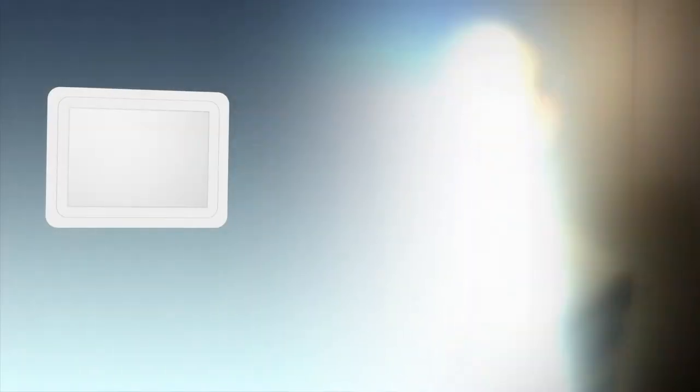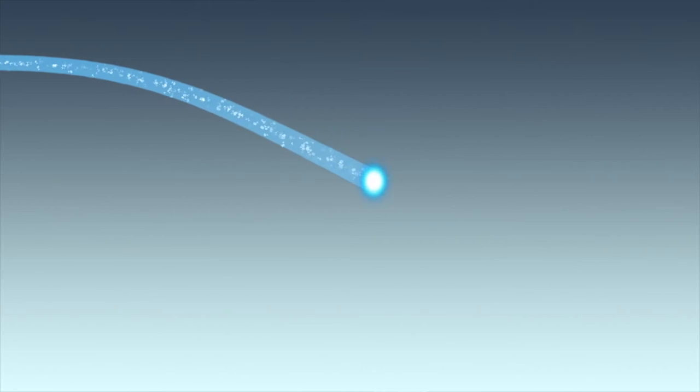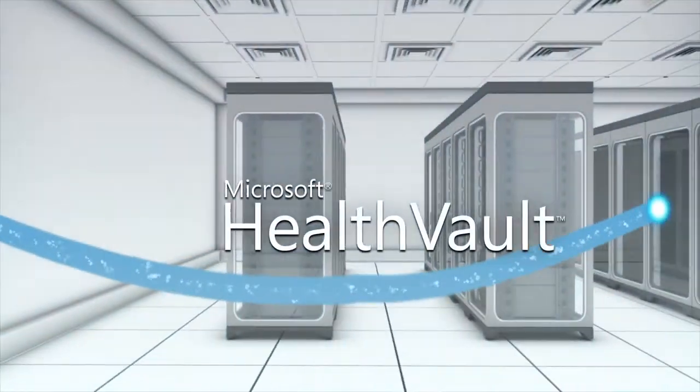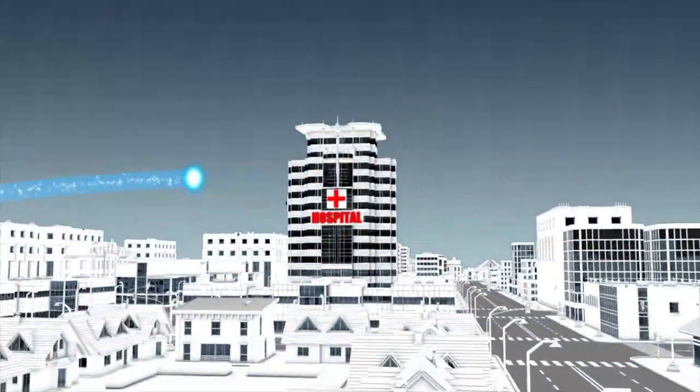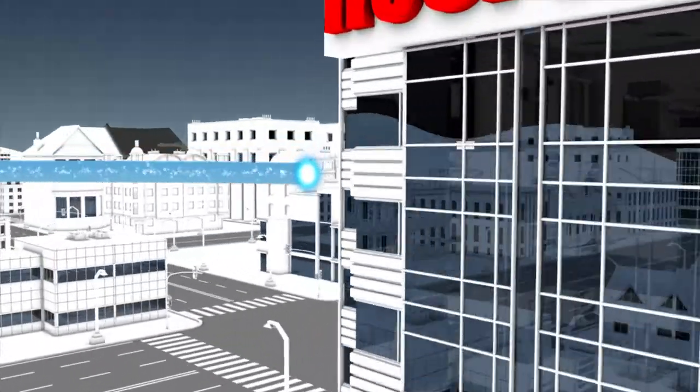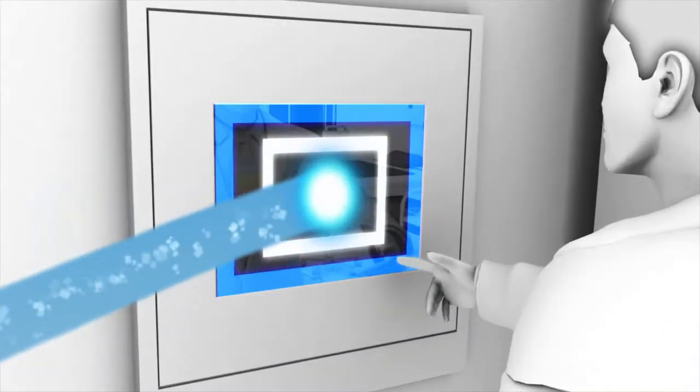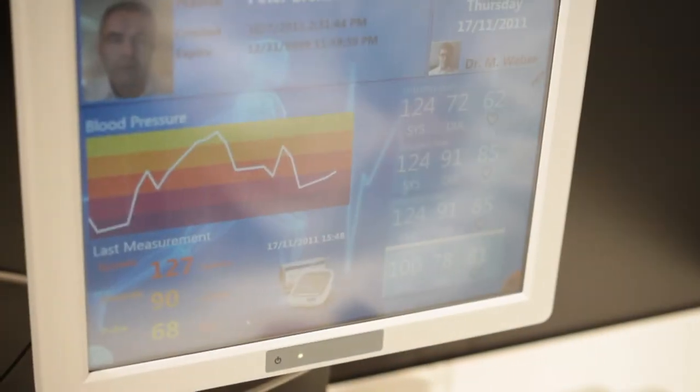The data captured by the Home Health Hub is transmitted to the cloud by Microsoft Health Vault, a cloud service currently active in the USA, Canada, UK, and Germany. This data can be reviewed seamlessly and easily by a doctor via this panel display.